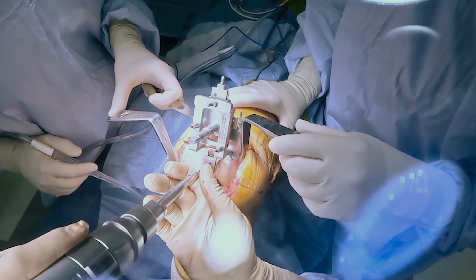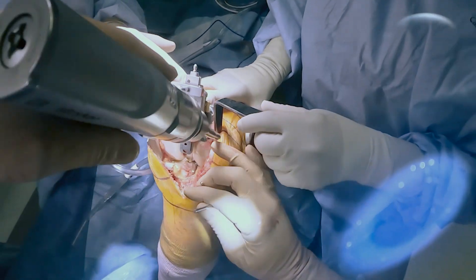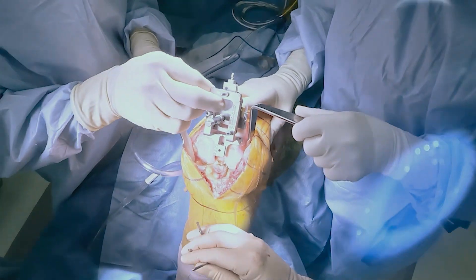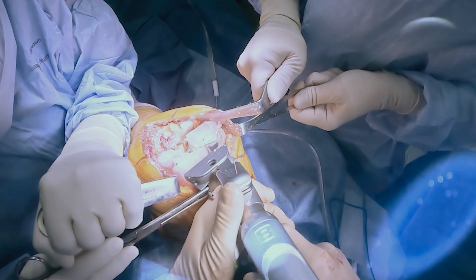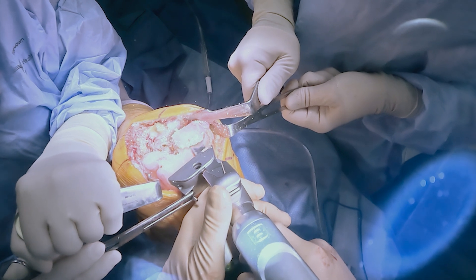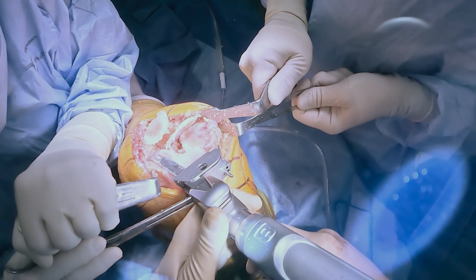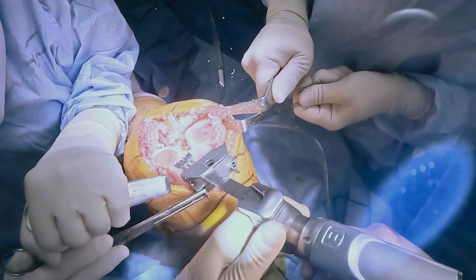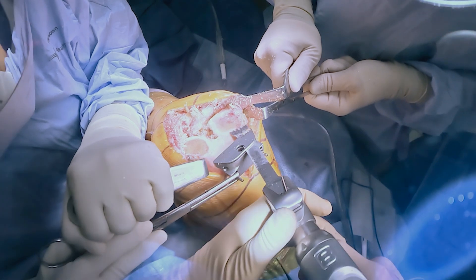Once the resection is set, we will pin the distal femoral cutting block. This is a pretty straightforward workflow for me. It really has no difference from manual instrumentation and doesn't slow me down at all. Once the distal femoral cutting block has been pinned into place, I'm removing the distal femoral surface with an oscillating saw at our preset mechanical axis. It's very easy to use, very similar to the mechanical instrumentation per the provider you use.